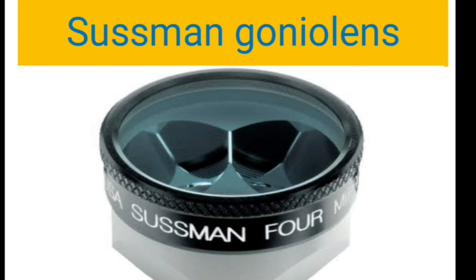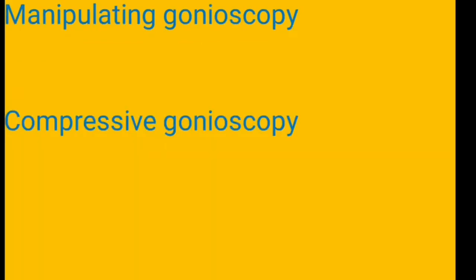So indentation gonioscopy can differentiate your appositional angle closure from the synechial angle closure, and this can be done only with the ZEISS 4 mirror, POSNER's or the SUSSMAN, but not with the Goldmann types of goniolenses. So this is about manipulative gonioscopy and indentation gonioscopy, also called compressive gonioscopy.